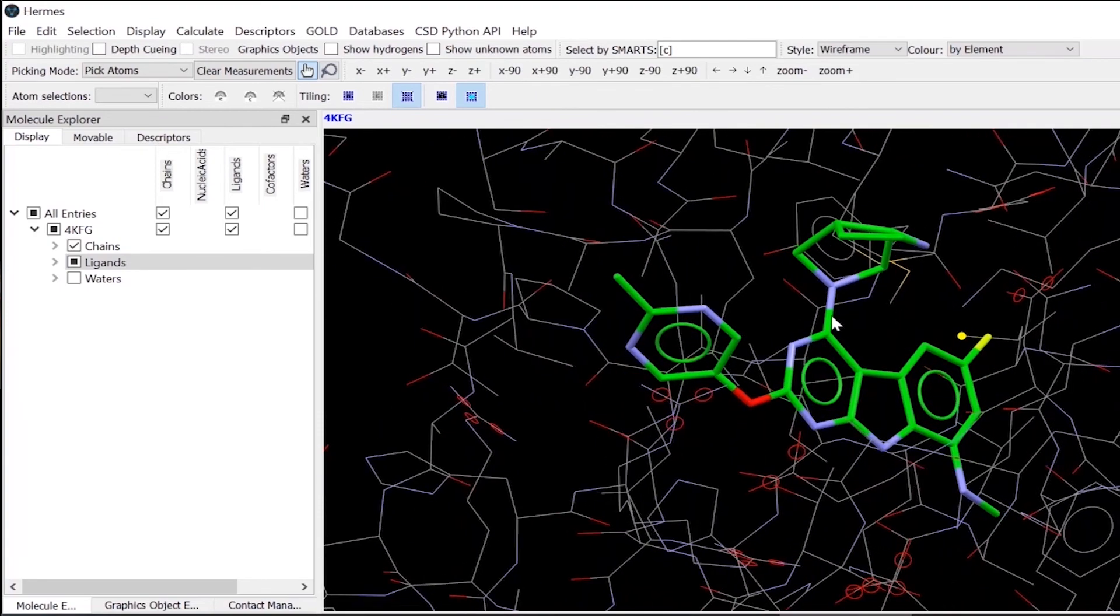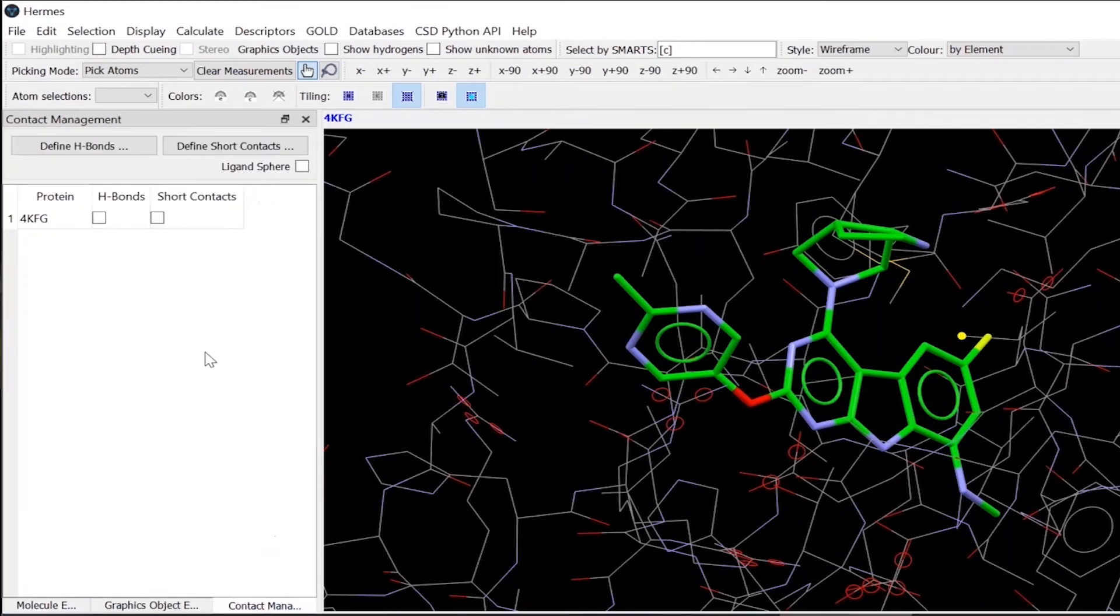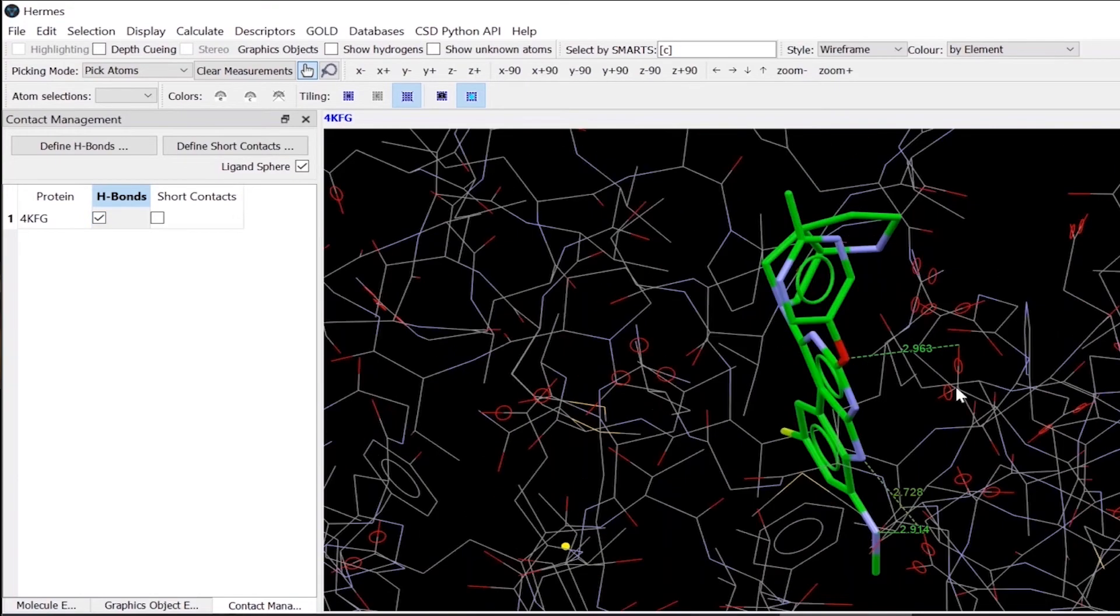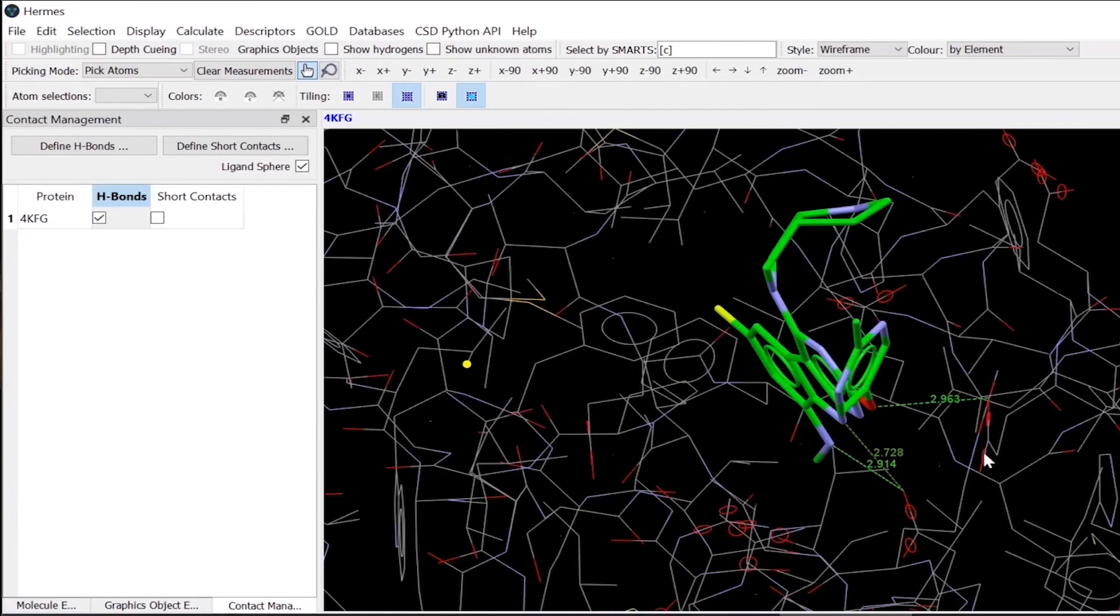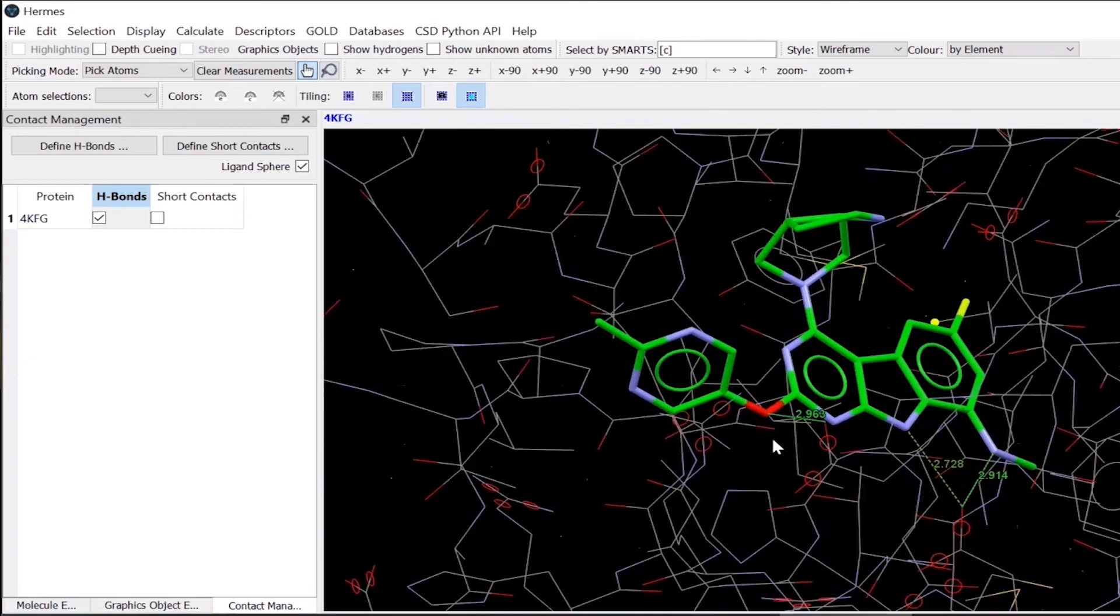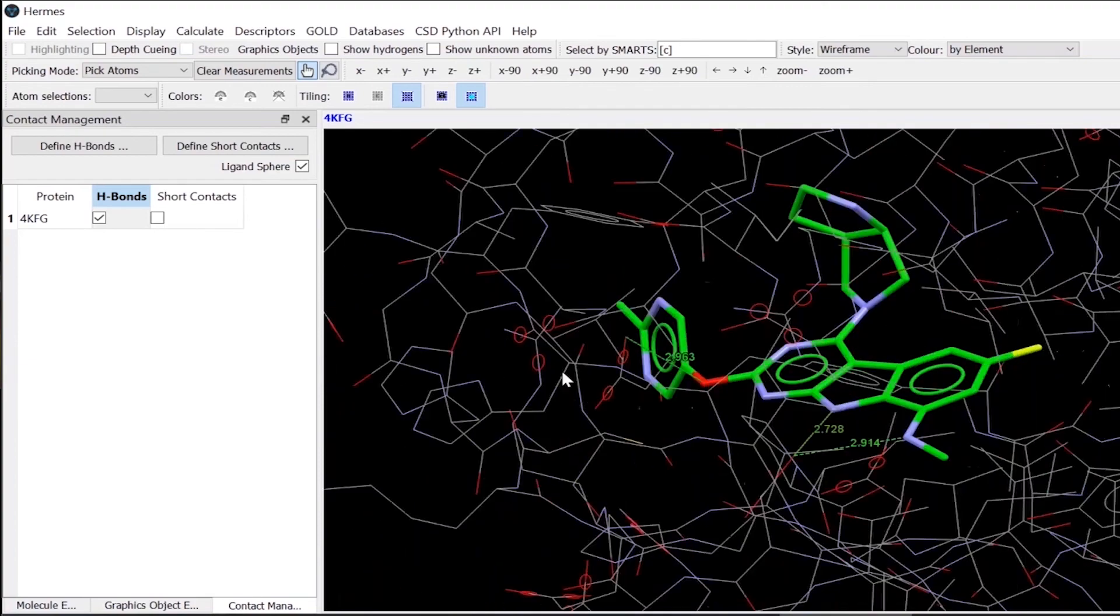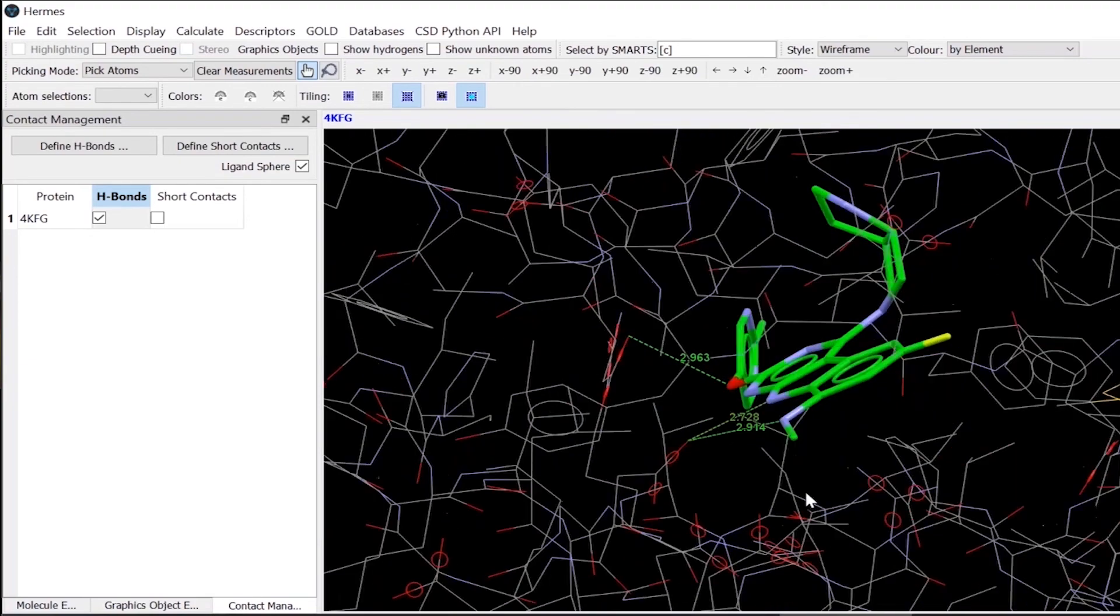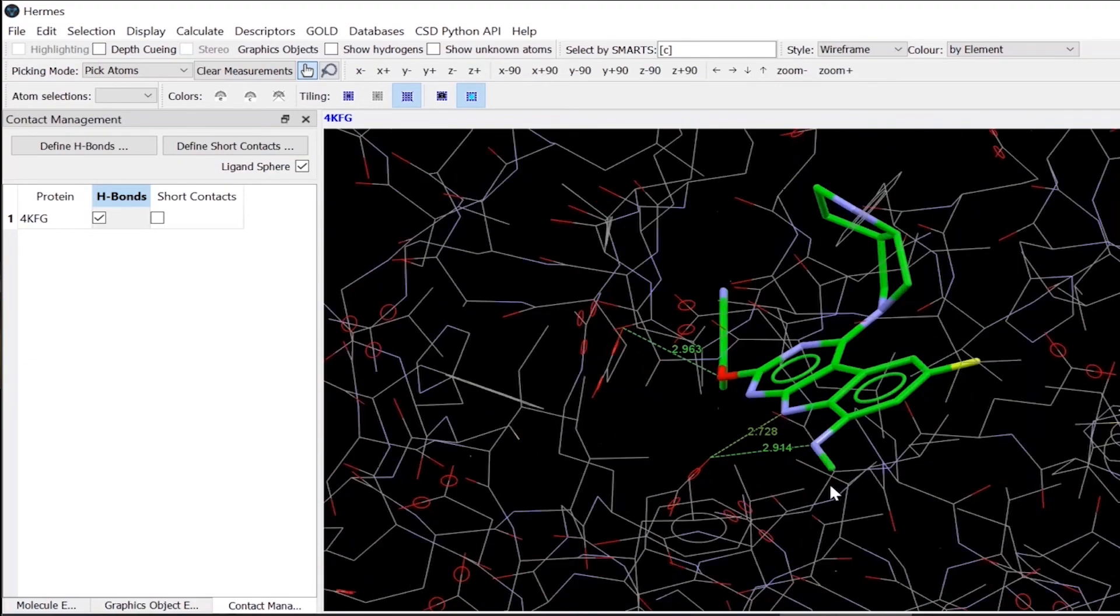So the next thing we can try is that we can find out the hydrogen bond interactions between the ligand and the protein. To do that, I will select, you can do it for the whole molecule. But in this case, I'm just doing for the ligand sphere, which is around six angstrom around the ligand. And I will turn on the hydrogen bond interactions here. And then you can see where my ligand is forming hydrogen bond interactions with the protein side chains or the backbones.